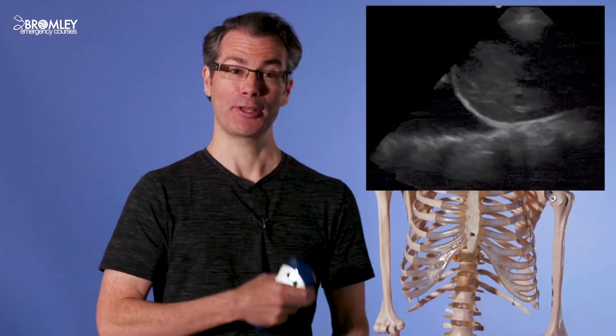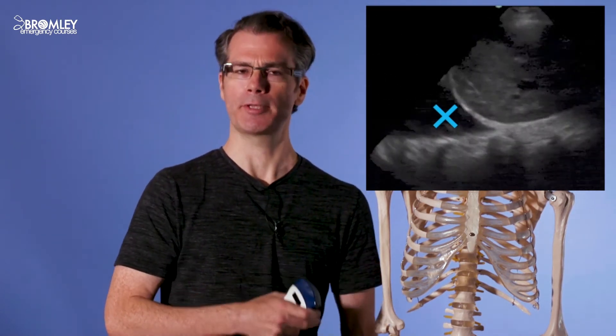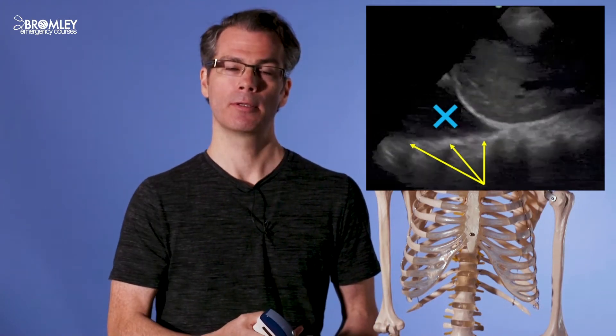Here's a video of a patient with some black around the liver. In ultrasound, black is fluid — in ultrasound terminology it's called anechoic, meaning no echoes because ultrasound passes very easily through fluid without causing any reflections. Here's another video of the right upper quadrant slid slightly higher up into the thorax. You can see a black area above the diaphragm in the thorax, and also the spine behind it has become visible. Normally you don't see the spine in the thorax because the lung is full of air and doesn't allow transmission of ultrasound. But here the fluid is allowing the ultrasound to pass through, so we see the spine in the thorax. This is called the spine sign.